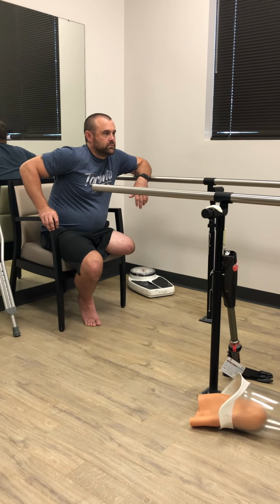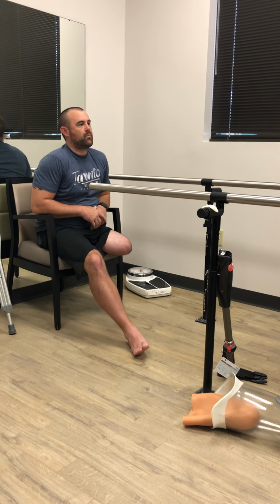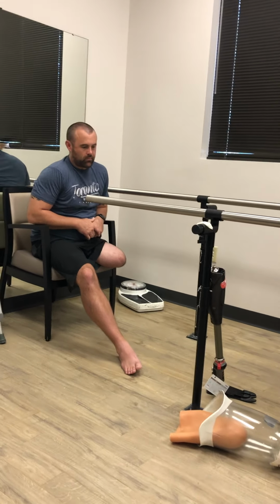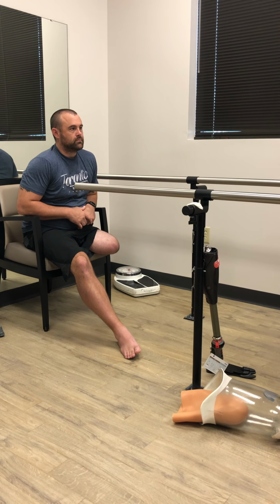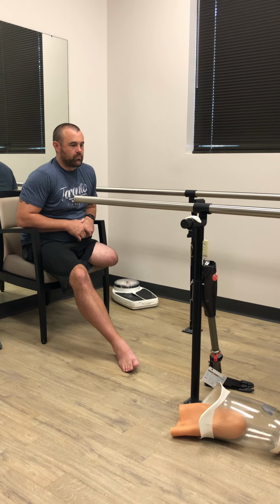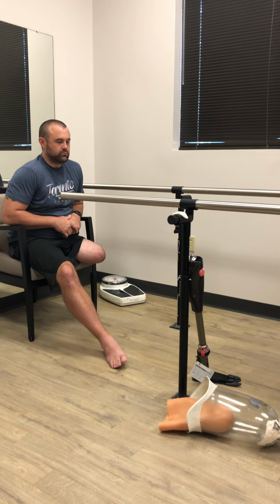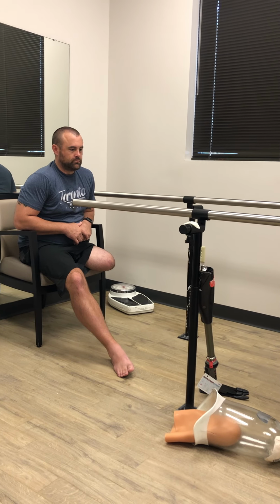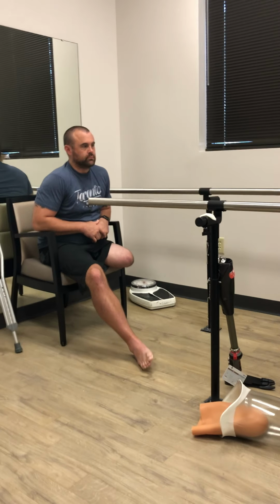So, you still may have a little bit of time where you gotta roll into the bathroom and dry everything off, and then you have to completely dismantle. Nah, I think you'll get to where you know exactly how to do it. You'll just pull your liner off, dry your leg, dry your liner. It'll be a 2-minute deal, and off you go again. Might you have to do it? You might. We're just figuring you out going out of the gate.